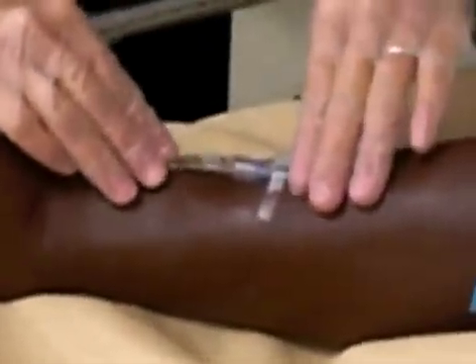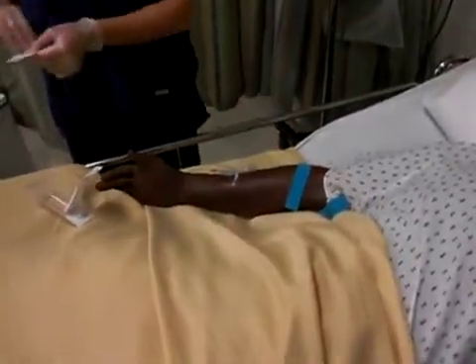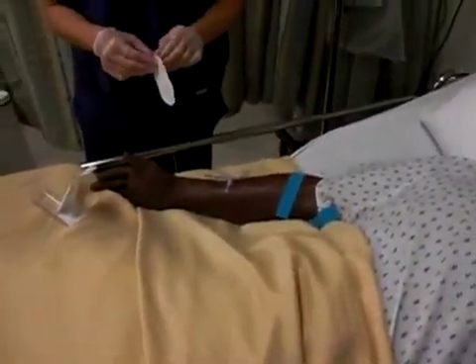A sterile dressing is applied over the IV site and make sure the connection between IV tubing and catheter hub is uncovered.